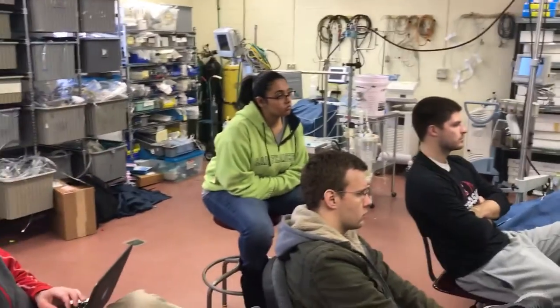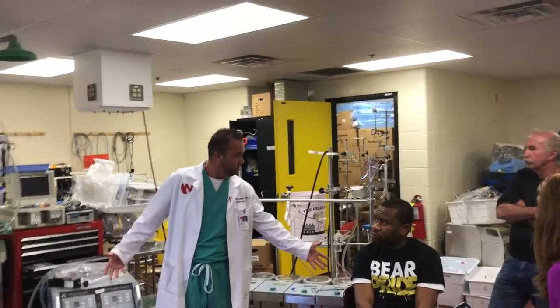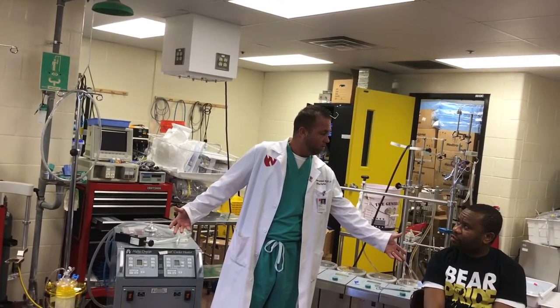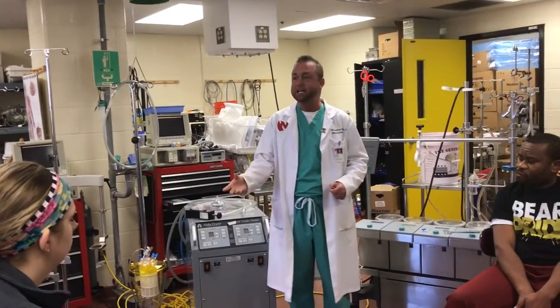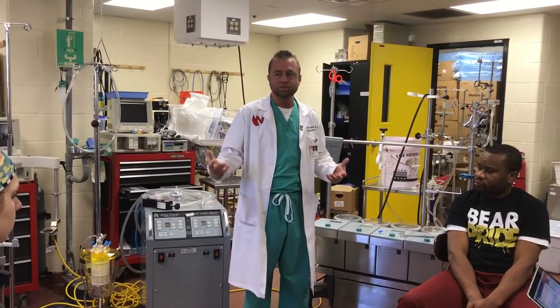Today we'll initiate bypass for practice — I won't be grading the initiation phase — then I'll communicate and ask if you're ready. When you drop your flow, that's the signal the cross clamp is going on and the maintenance phase has started. We'll establish cardioplegia without running it for the full duration, talk through the vent work, and I'll observe whether you're compensating for shunts.